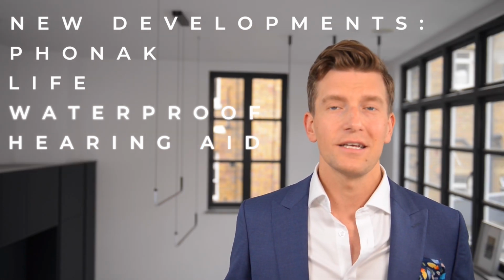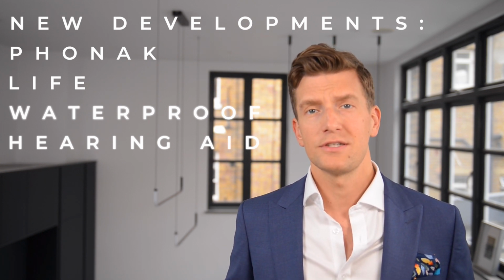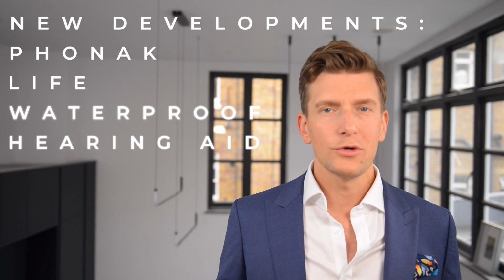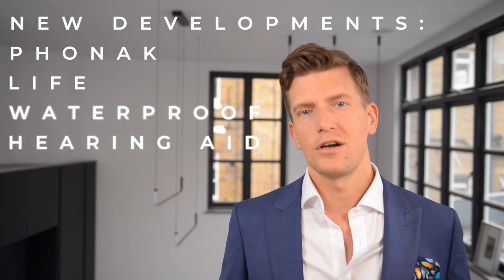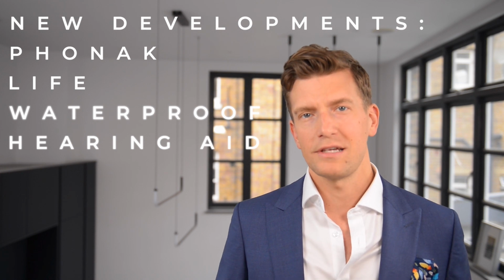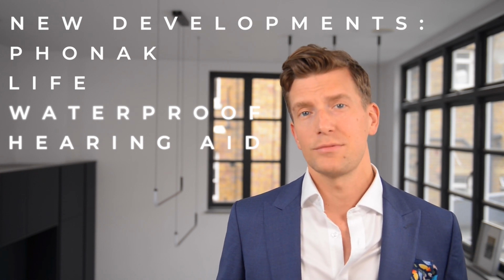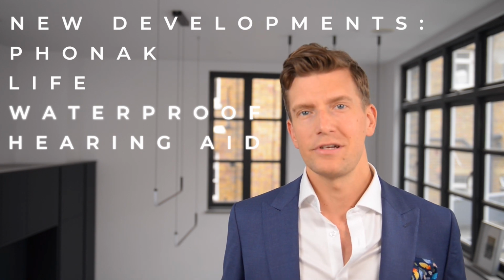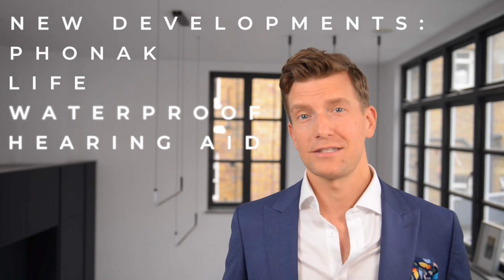Phonak, if you're listening, it would be great if you can start to look at doing this for both your in-the-ear hearing aids and your Lyric hearing aid as well. Of course, they live in a far more hostile environment due to the moisture ingression and the wax ingression that we get from those hearing aids, and they're actually far more likely to break down. So if we can see this technology taken over to in-the-ear hearing aids, then I'll be really excited.